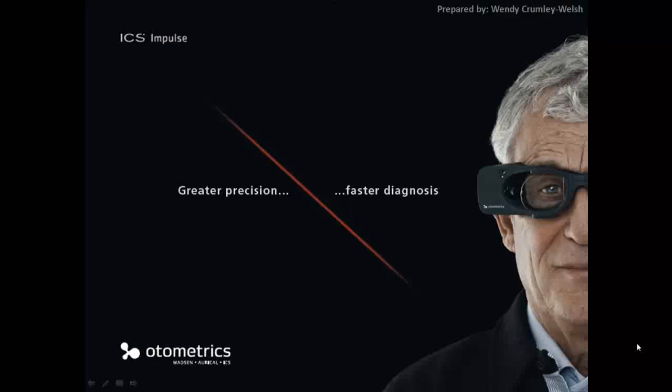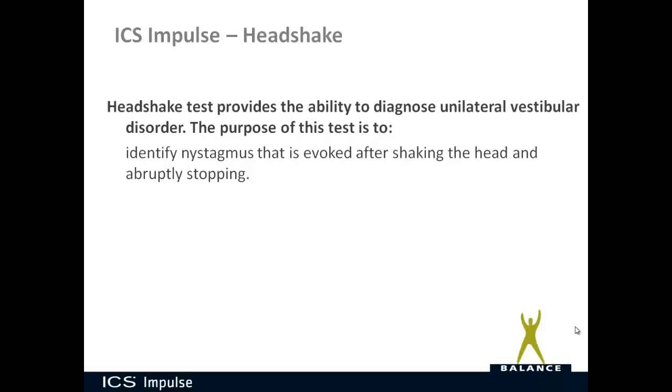Today we're going to be talking about doing the Headshake test. Now this test isn't in the default test battery for the ICS Impulse, but it's very easy to add this test in and perform it if you want to do so.